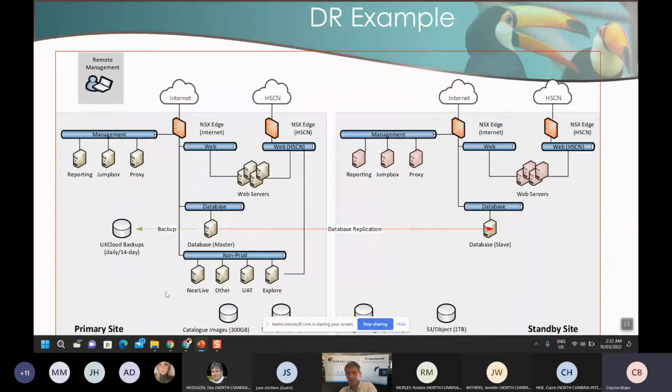Again, I think we've got 9 minutes. This is just a little bit more of the topology. I'll make these slides available for the technical people so you can look at these in detail, but it just shows a little bit of how everything's connected into the system.